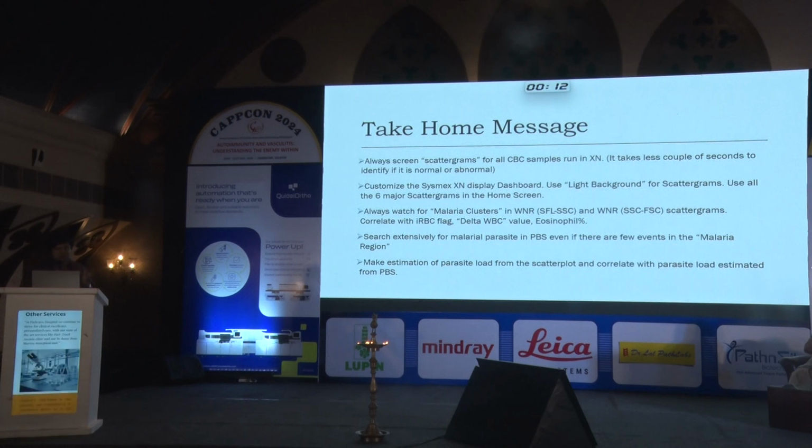So always screen the scattergrams. I think most of us actually screen the scattergrams, and we all should do. It will hardly take 1 or 2 seconds, and customize the Sysmex section dashboard with the light background. By default, the dark background is often turned on. Often it is very difficult to see.